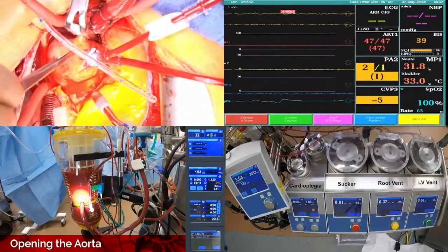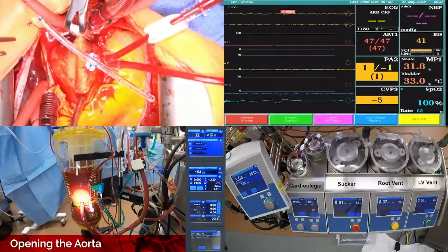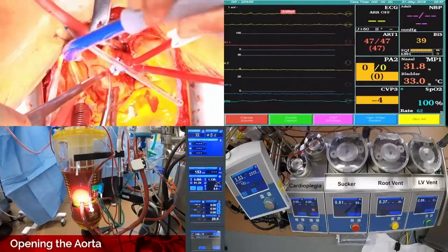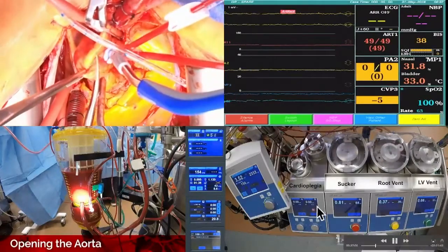There you go. You're in it. And look, he stuck the sucker in there. He's probably going to say, turn the sucker up. Well, let's watch, see if Mike does it. That's right down here.